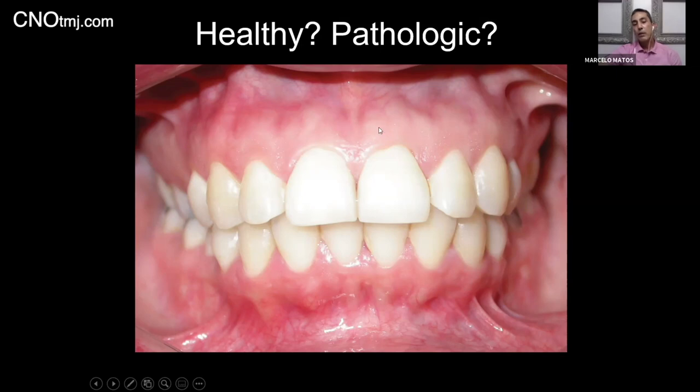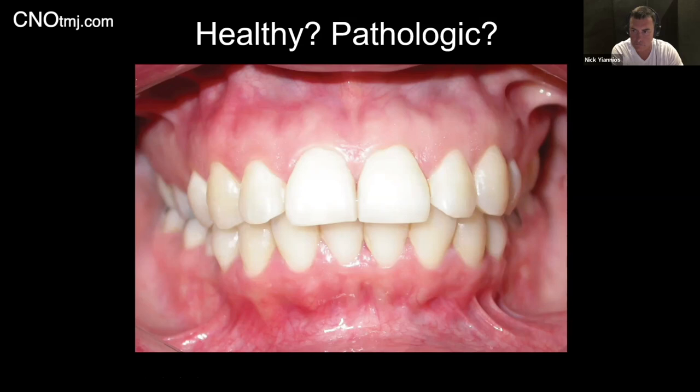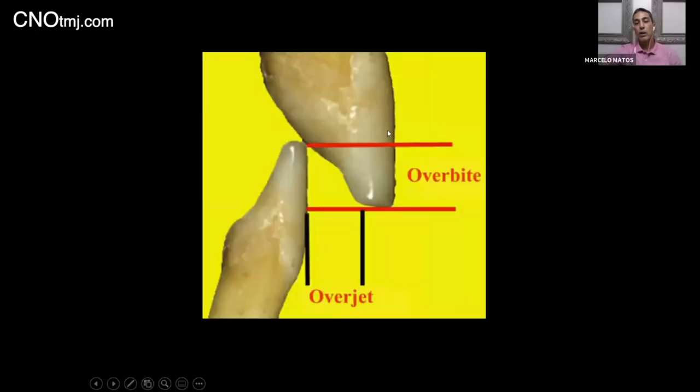So for that, you need imaging, MRI, CBCT as the fundamental image to study that. But let's say you have two cases and both cases have similar images. How do those same problems affect the individuals? Individual A may have more symptoms and more changes in the way they function their muscles, and individual B may not. How to test that? And how to understand the vertical dimension, not from a visual aspect as we usually do?